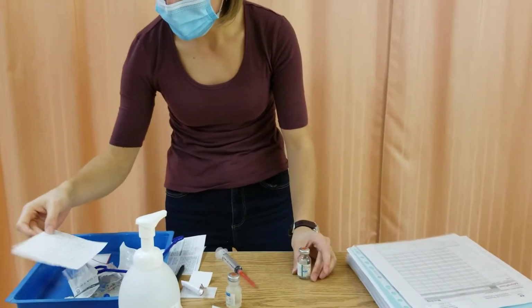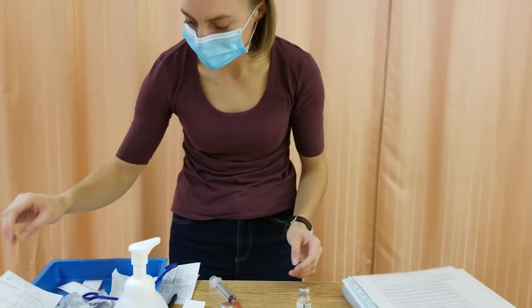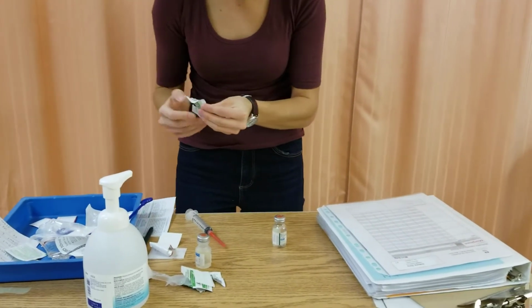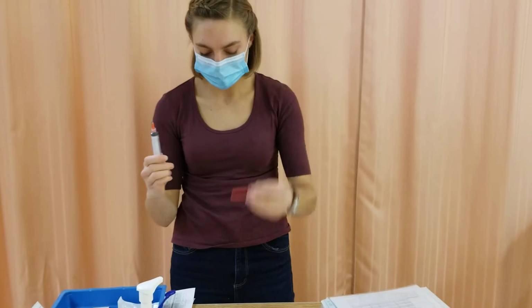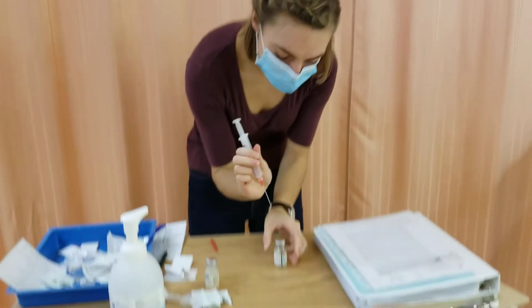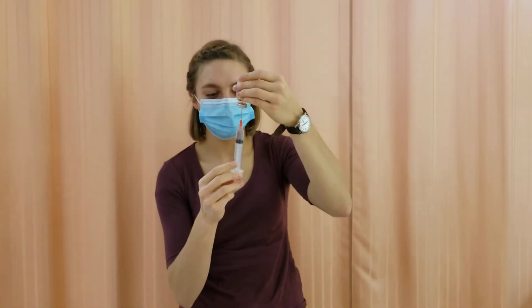And now I'm drawing up 4 mils of medication because I have 250 milligrams per mil as my concentration right now. So I swab this again for 30 seconds, let it dry for 15. I'm pulling back 4 mils. I inject that into my medication, and then I'm pulling back 4 mils into my vial.